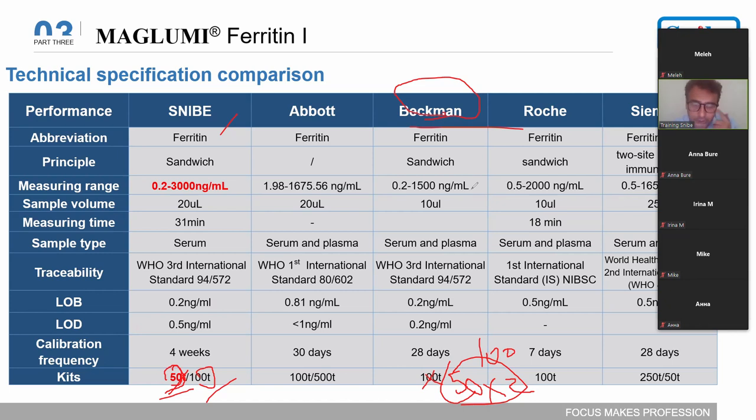If they want to enhance the onboard stability, they can put the reagent on board only when they want to run patients. With this procedure, they will enhance the onboard stability or the calibration interval for slow running parameters, or trouble analytes, those analytes whose onboard stability is compromised.